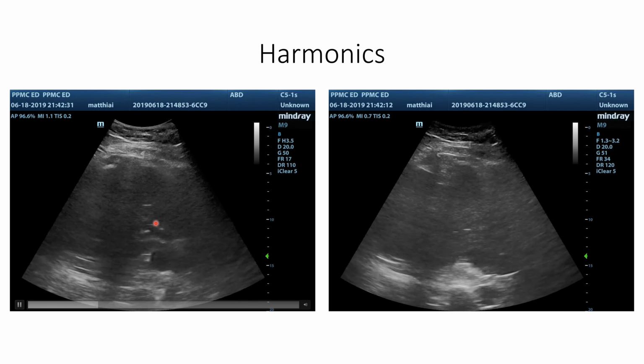And it's actually really important to conceptualizing why selecting the right preset is probably the most important thing we can do in knobology. So if you're listening to this slide at this point, or if you just believed what I said in the first slide, that selecting the right preset is important, you'll basically get the equal outcome where you select the right preset.